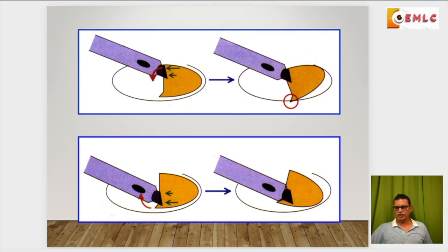So you should be very cautious that you should hold it either at the center of the side of the nuclear fragment or slightly towards the posterior plate of the nuclear fragment, so that when you try to do the emulsification, you get the chunks somewhere deep inside and a larger area, and the posterior edge should not bang on the posterior capsule.